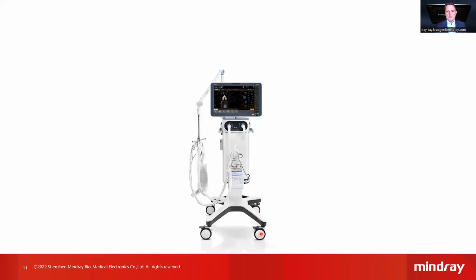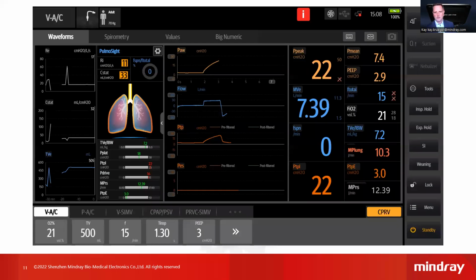Here we see Mindray's SV800 high-end ventilator. If we zoom in on the interface, we can see different displays for mechanical power. Here the mechanical power is directly displayed, 12.39 joule per minute in this scenario.